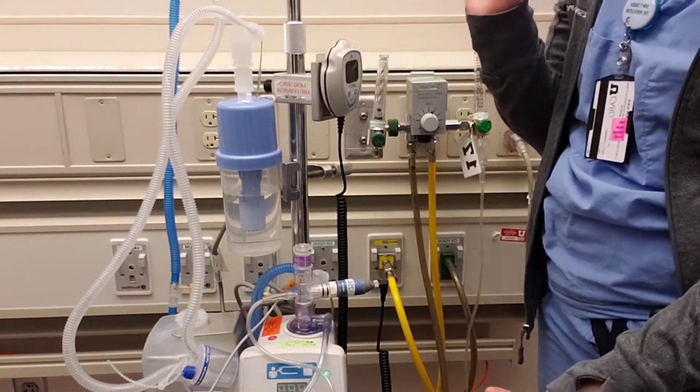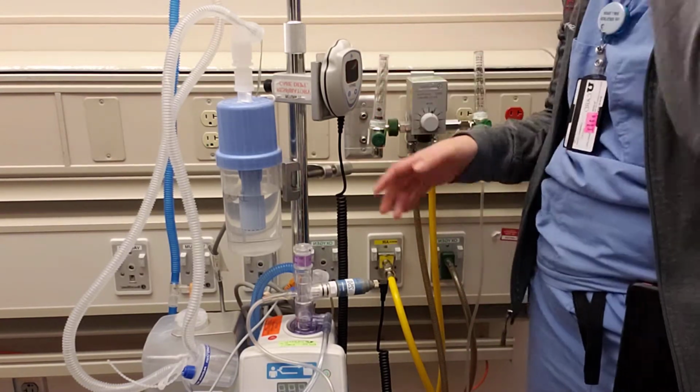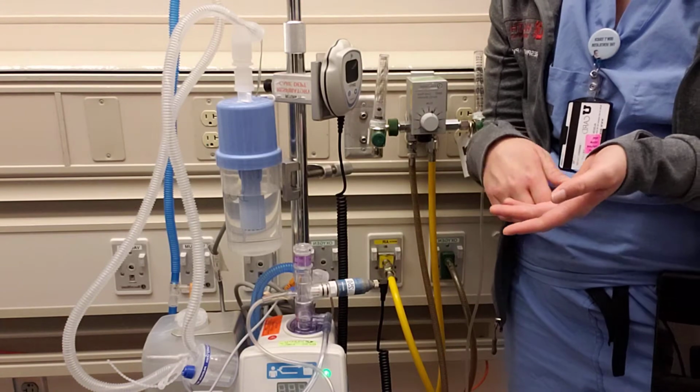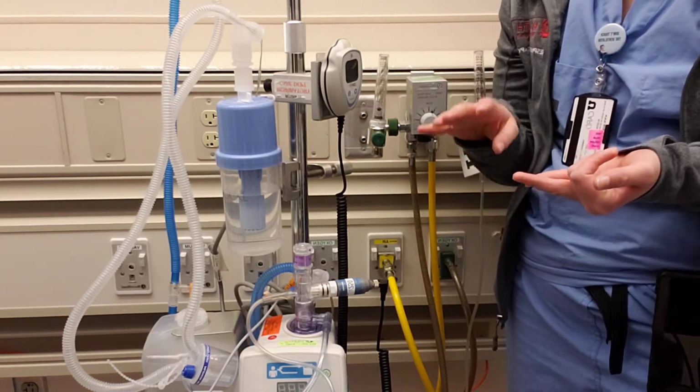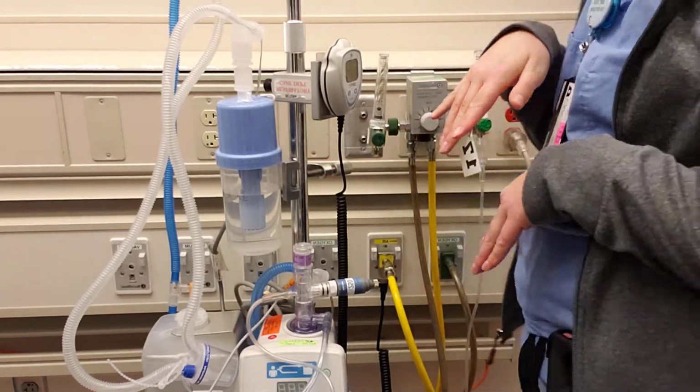This is one version of a bubble CPAP machine. There can be different versions, but just as with any respiratory equipment, they all do the same thing. They're all beneficial the same. It's just where what adapters go where.